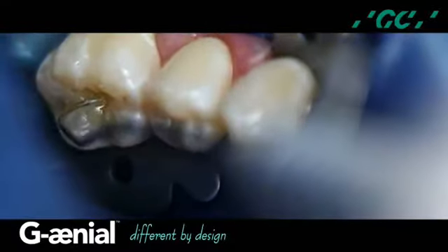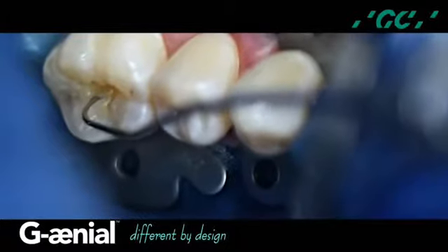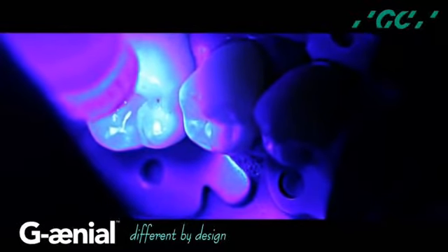I now use an A2 shaded G-aenial universal flow and the successive cusp buildup technique with an 1112 Explorer tip and light cure for 10 seconds.